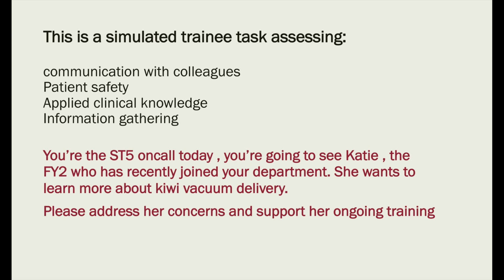I believe that you came today to know more about Kiwi vacuum delivery. Yes. Okay. Can you tell me why you want to learn about that? Well, I haven't seen it before, so I wanted to know how it's done. Don't worry, Katie, I will tell you everything about it today. Before that, do you know anything about Kiwi vacuum delivery? Yes, I know that we apply it when we need to help the mother deliver her baby. We apply a cup to the baby's head.